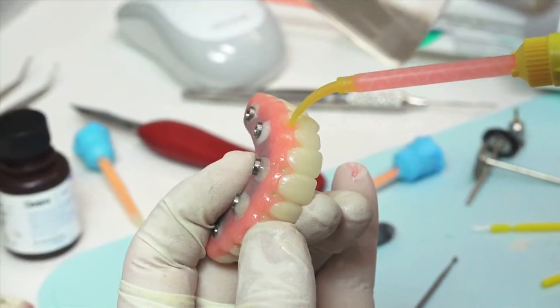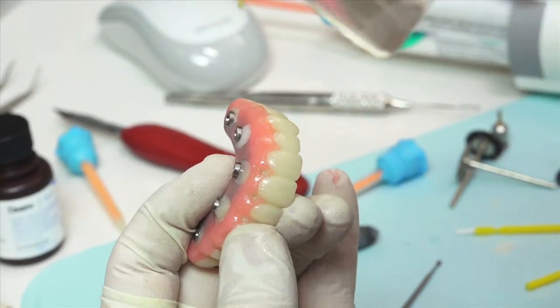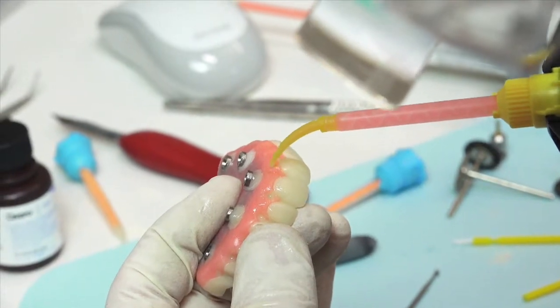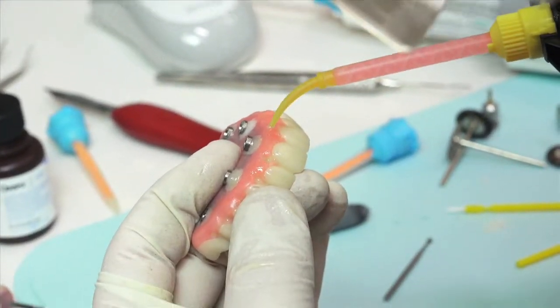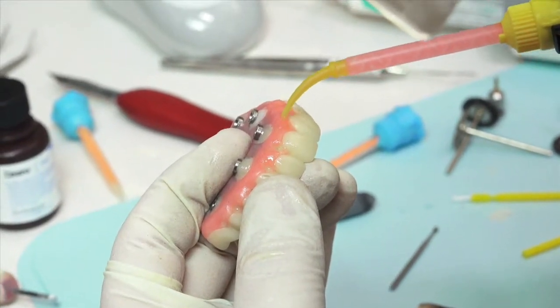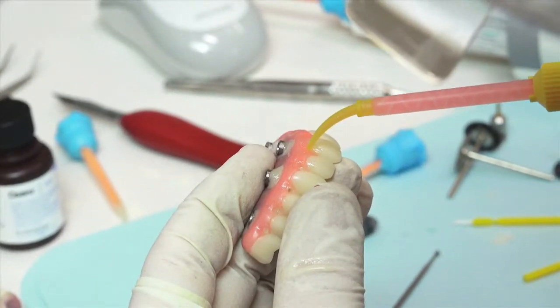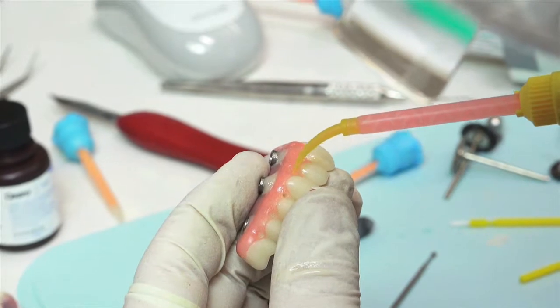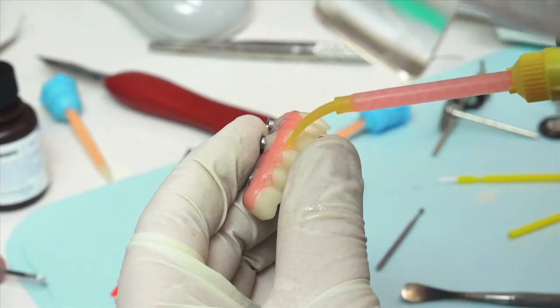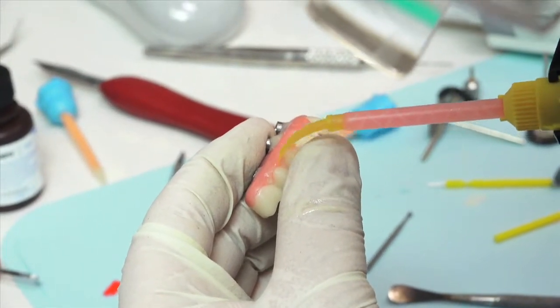If needed, fill in any voids in the injection sites on the buccal. For those patients who demand high aesthetics, if a white material was used to lute the temporary cylinders, covering these areas with a pink material may be needed. If so, leave a recessed area at each of the injection sites, or you can remove some material with a small instrument before it sets or before you light cure it. Another option would be to use a small round burr after the material is set and create these recessed areas. Then, using a pink bisacrylic material, simply apply a small amount into these areas, then smooth and shape as desired and light cure.